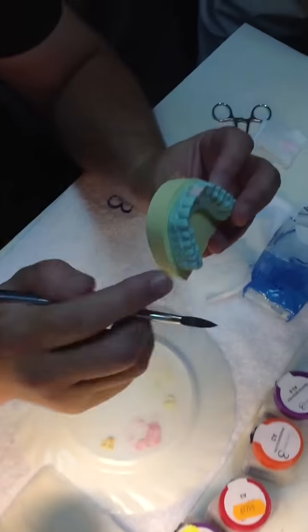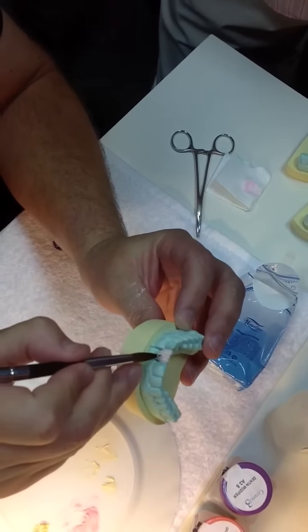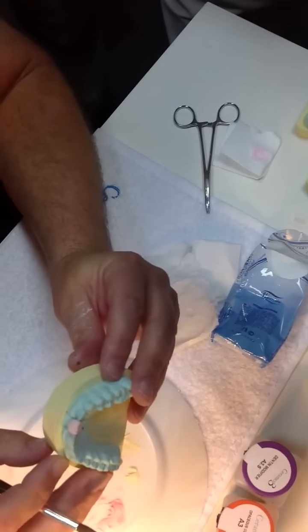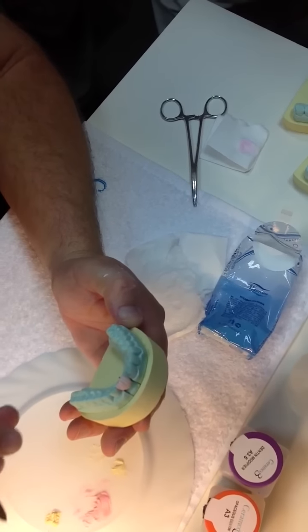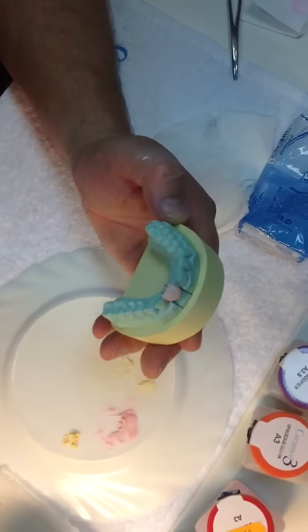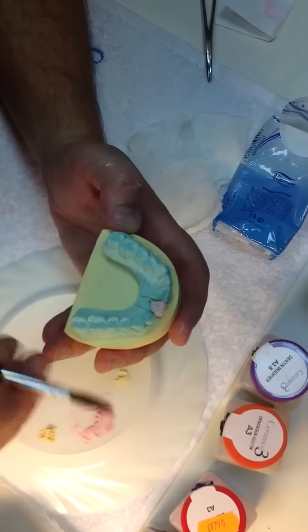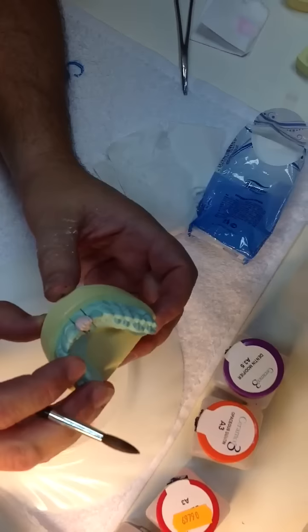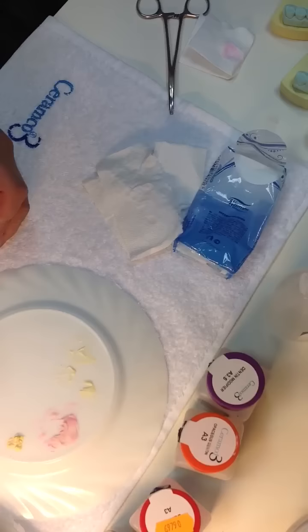So cutting those in, got some different heights. Some have gone deeper than others, so that we'll create different thicknesses of enamel. As well as using different enamel materials, by creating different thicknesses and layers of enamel, we'll get slightly different effects from the material. Different mamelon sizes are good, because the enamel will lie thicker in some places and thinner in others. It will look very natural.